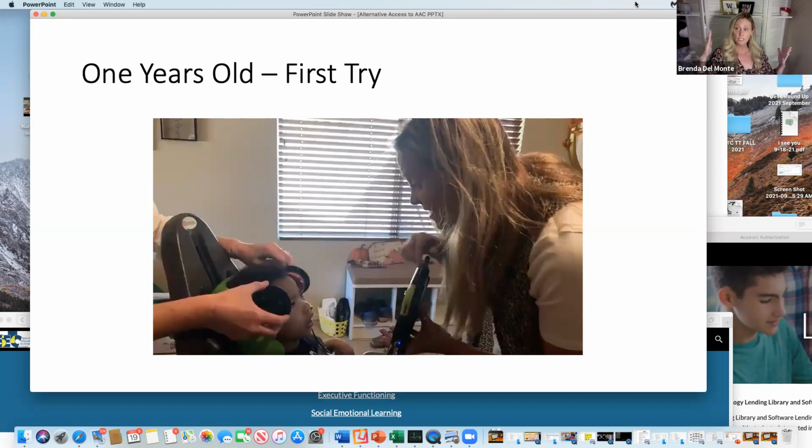The thing about 2-step scanning is that it goes bubbles, songs, kisses from mom, bubbles. When I hear the one I want, I come over here and hit I want bubbles, and it can take me as long as it takes me, because I'm the one advancing. I remember telling her, and she goes, well, yeah, that's in Linda Burkhart's Stepping Stones right there, that 2-step scanning is easier than 1-step. I was like, oh, should have looked at that first.